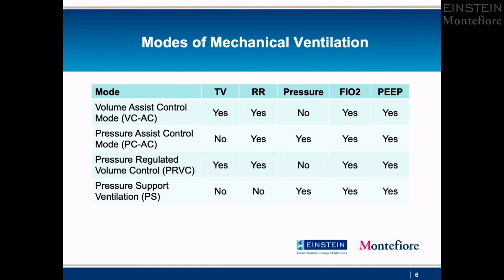Lastly, in pressure support mode, we set an inspiratory pressure to augment spontaneous breaths. A backup respiratory rate is not set in this mode. So if there is no patient effort, apnea would be recorded.